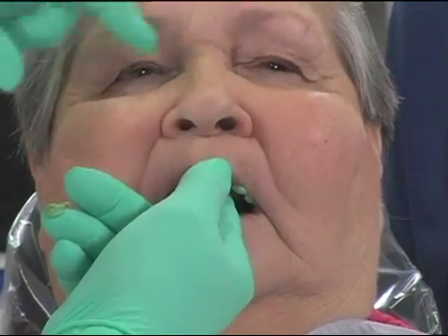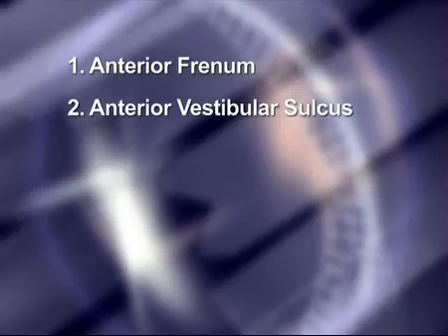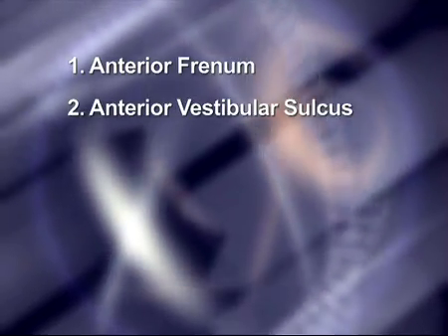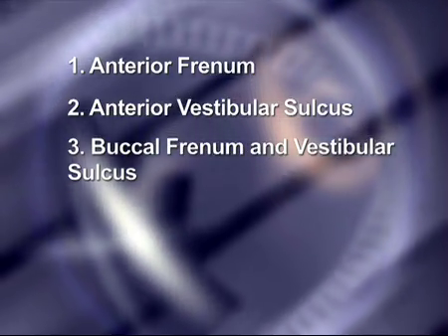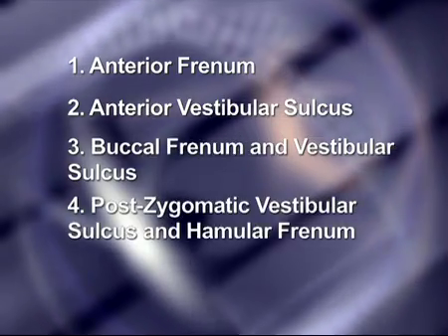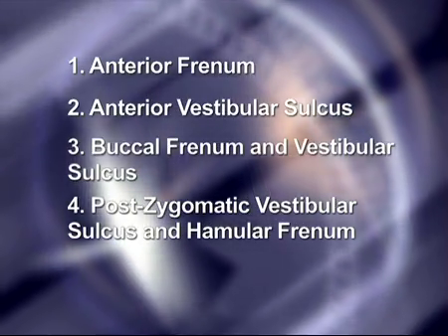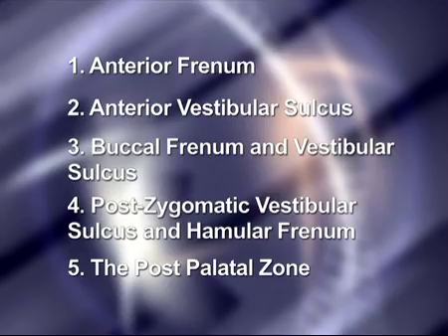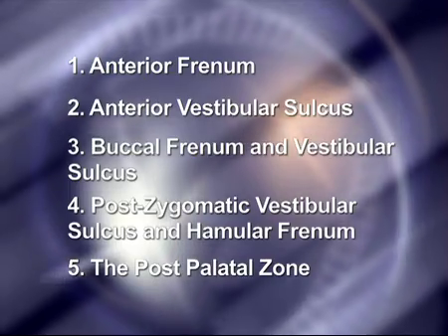Border molding the maxillary arch can be optimally accomplished by detailing the functional movements of the following. 1. Anterior frenum. 2. Anterior vestibular sulcus. 3. Buccal frenum and vestibular sulcus. 4. Post-zygomatic vestibular sulcus and hamular frenum. And 5. The functional hard and soft palate junction, also called the post-palatal zone.